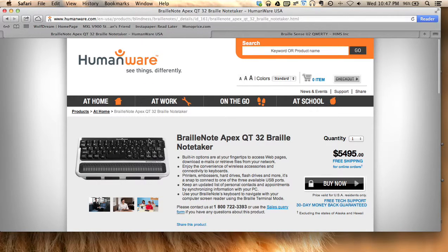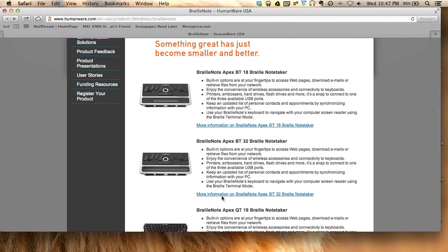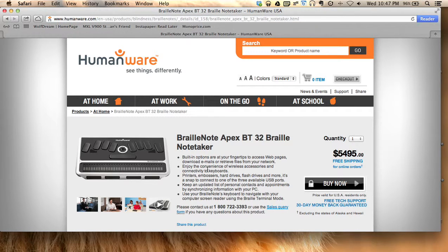Now, future proof. Will these devices be adequate enough in the future? I believe they will still be around, and I believe that the Braille Note will still be around. It is so cool, because one of the things that I have done is I've made a custom Excel spreadsheet, sort of, because you can do that within the Braille Note software, and I've made that for my audio logs, using Pro Tools and all that kind of stuff in our audio class. So I've done that, which is pretty awesome.